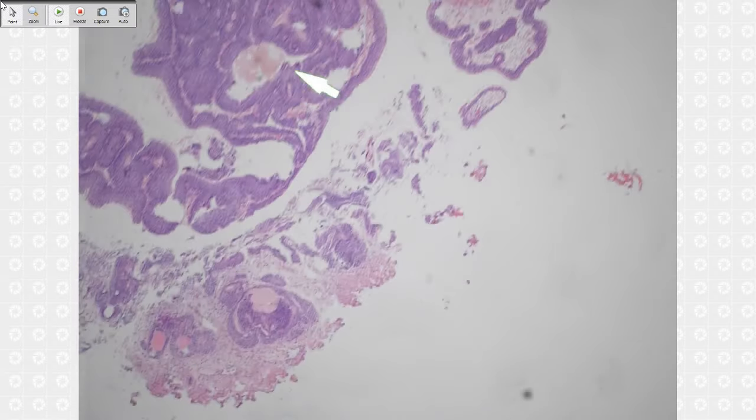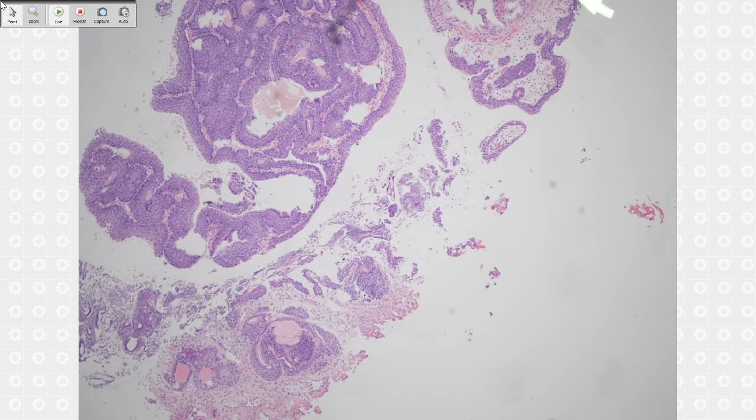Dr. Singh: How do we look for lamina propria invasion? Lamina propria invasion, this is the lamina propria, right? This one has no invasion, just a growth pattern. For lamina propria, do you mean in this case or a different case? Yeah, I was actually thinking about the previous case. Lamina propria invasion, you go to one of the urothelial carcinomas.